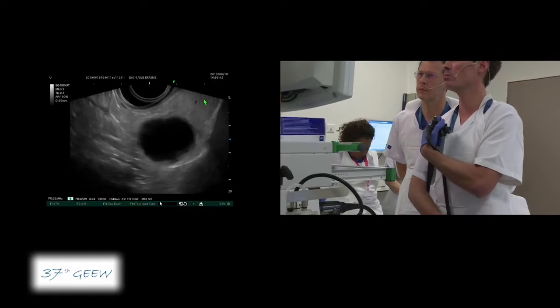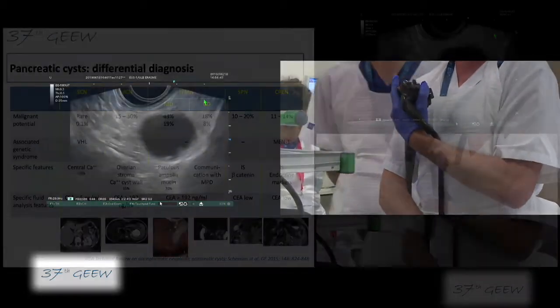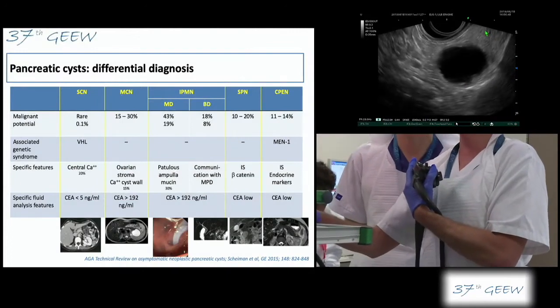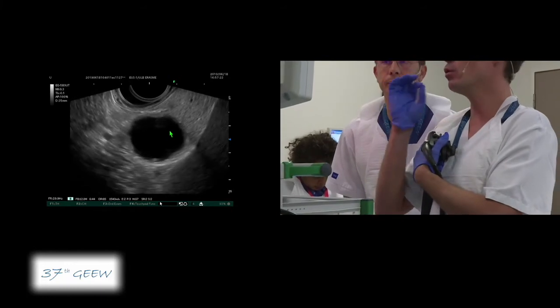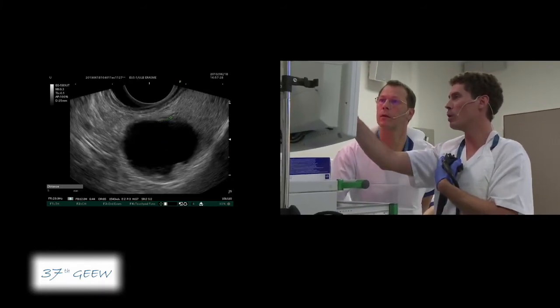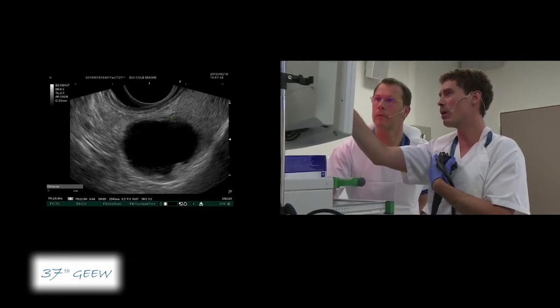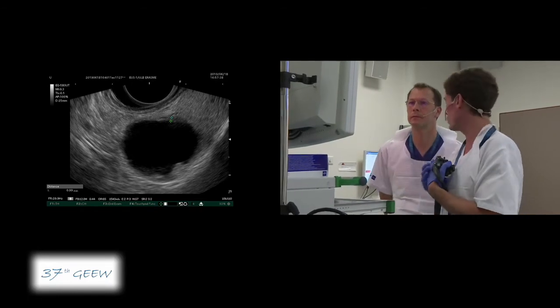You see, I do movement from one side to the other side, and you never see something relating the cyst to the pancreatic duct. And after, you have to look at the wall. There is a little wall. You have the parenchyma, normal. You have the anechoic. But if you look very carefully, you have something in between. So you have like a 1 millimeter wall space.